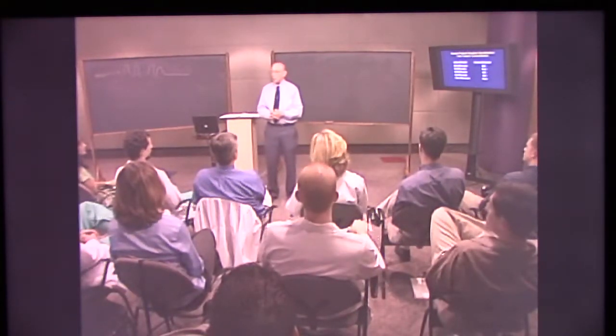So how are you going to determine whether that's occurred? Because it isn't worth the price, is it? No. Most common way is somatosensory evoked potentials, or you can use motor evoked potentials. Okay, and tell us about those. What is a somatosensory evoked potential?